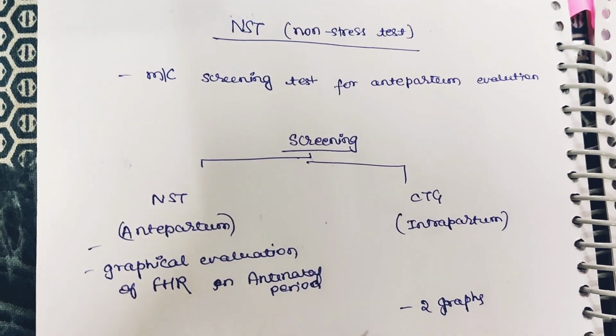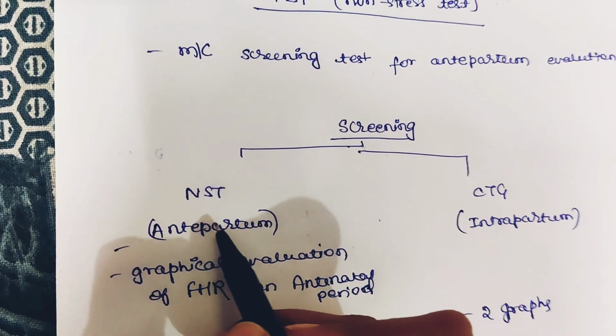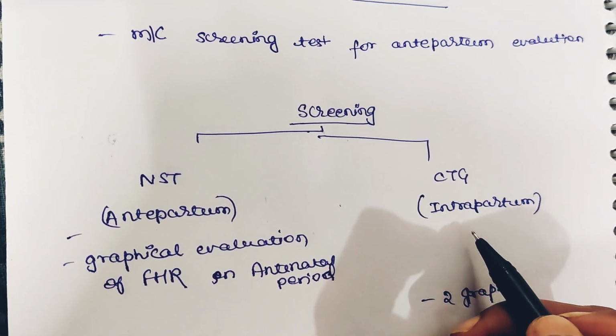we can do CTG. CTG is the same. CTG and NST are the same. The difference is that non-stress test is used in the antepartum period and CTG, cardiotocography, is used in the intrapartum period.